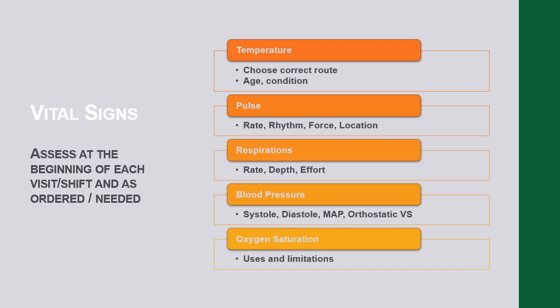The other thing that's important to note is it's just measuring color, it's not measuring oxygen. And hemoglobin is red anytime anything is bound to it. So if carbon monoxide binds to hemoglobin, so somebody has carbon monoxide poisoning, their pulse oximetry, or the oxygen saturation number, is oftentimes very high, even 100%, even though their actual oxygen level may only be 50 or 60. So there are definitely some times where you get a false reading.